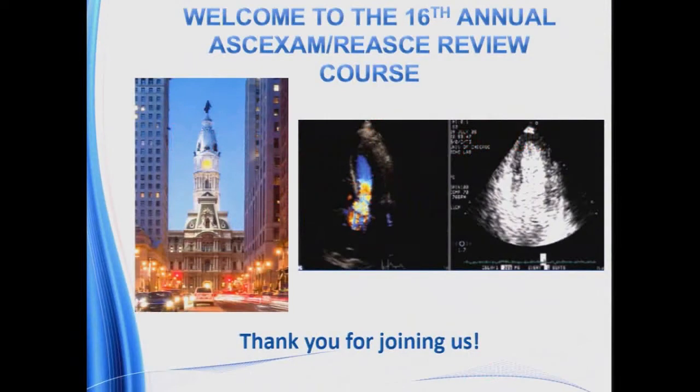Now, if any of you have any questions, the collector did collect a couple, but you can certainly bring them up if you'd like. Okay, the first question, I'm afraid that Dr. Wiggers may not be able to answer. Can you please provide the precise reference for Dr. Feigenbaum's review of M-mode? No, but we'll get it to you. Yeah, we will, as soon as I get on the internet. Exactly. Another one. Very good.